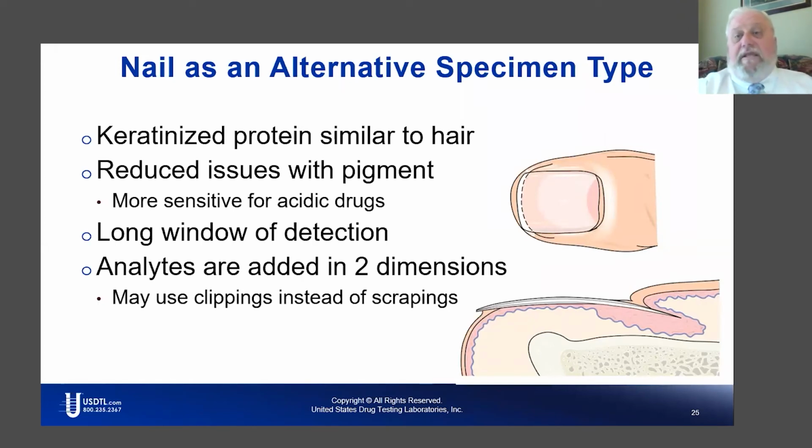And I see over and over again donors and clients going in the wrong direction and wasting their time, their money, and the specimen and resources when they go for recollected specimens, which are not going to help with the interpretation, or they send them off for DNA analysis and destroy much of the sample. Maybe they can't have it retested because now they did DNA analysis. When a donor refutes the test, the first thing that we should do is respect that opinion and offer the opportunity to have that specimen retested, either at our laboratory or another laboratory.